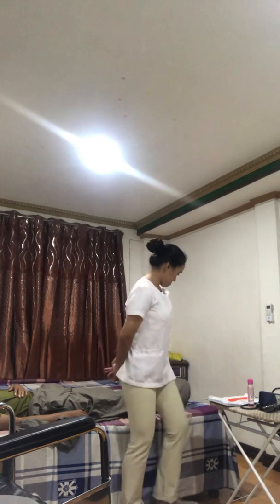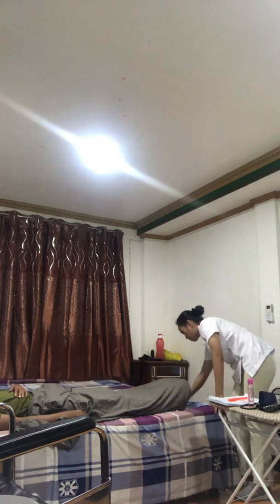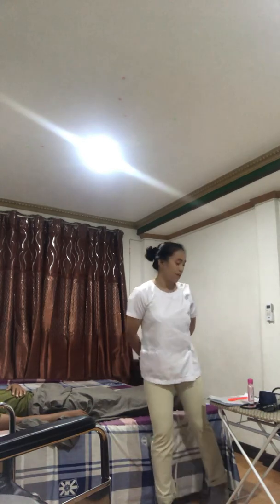Next, adjust the height of the bed to the lowest possible position. Rationale: to reduce distance that the client has to step down, thus decreasing risk of injury. Next, slowly raise the head of the bed, if not contraindicated by the client's condition. Rationale: minimizing lifting, thereby minimizing discomfort for both patient and healthcare provider.